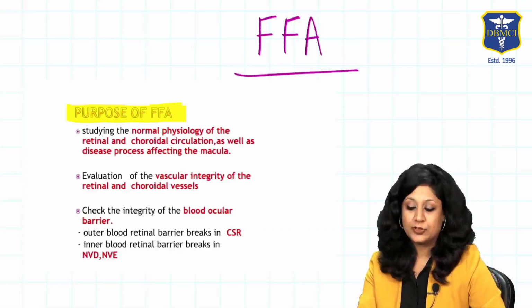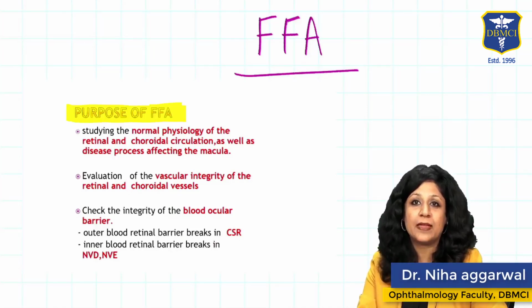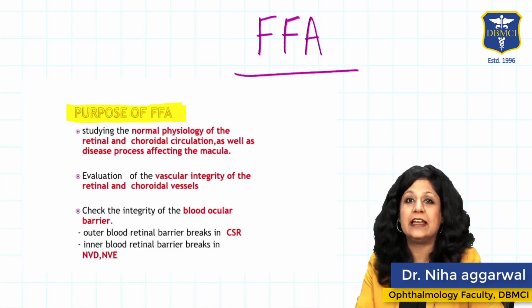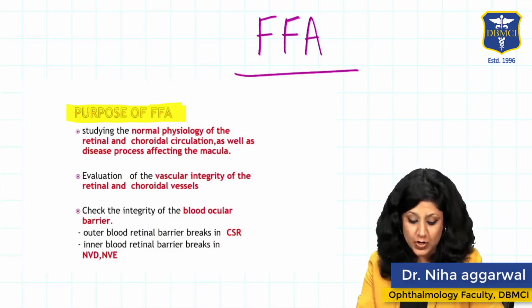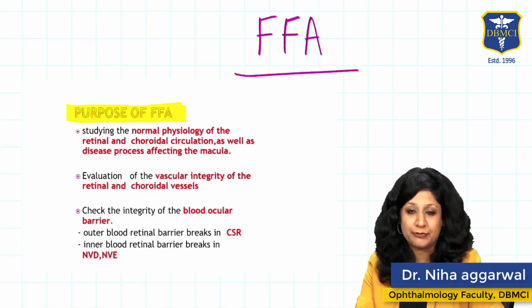Hello friends, so as promised, I am here with the very important topic of fluorescein angiography, because these images are always asked, recently in AIIMS November 2019 too. So let us try to understand the concepts related to this angiography.